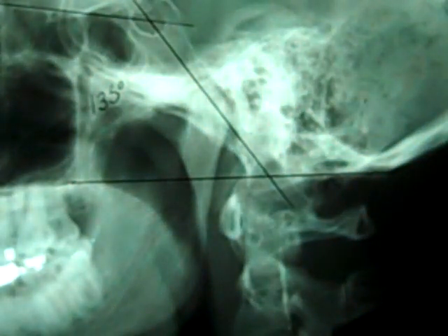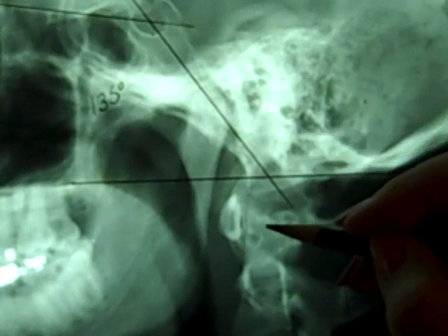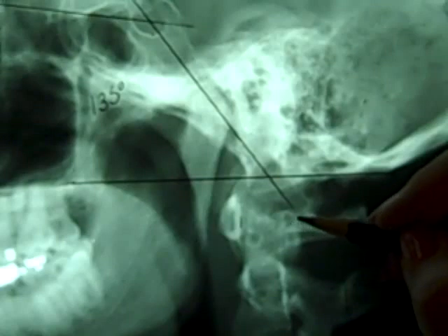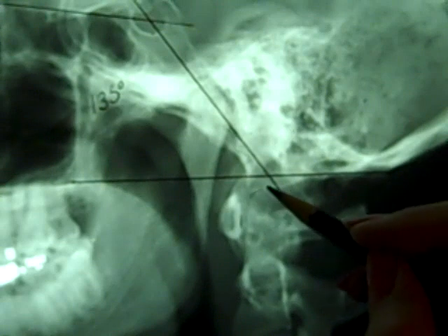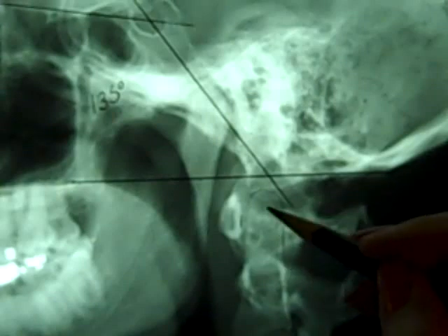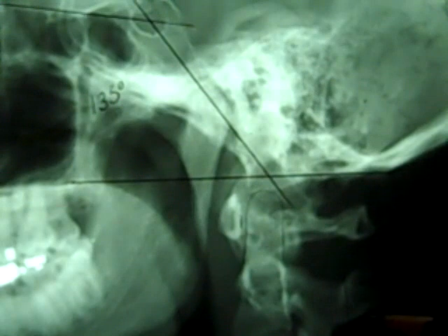Now what I'm looking for is the odontoid process to not be more than 8 millimeters above this line for males, and not greater than 10 millimeters above this line for females. And when you look at the odontoid process, on this film it is right across here, and here's the back of it right there. Okay, so if I drew that in for you, that is the odontoid process.